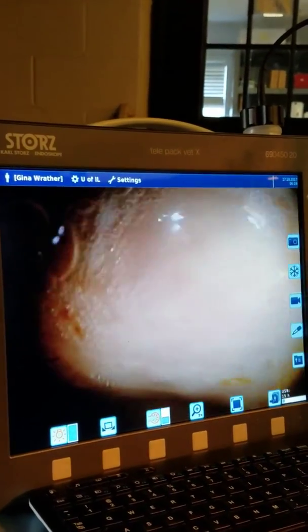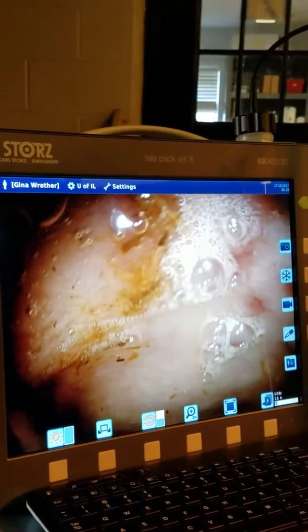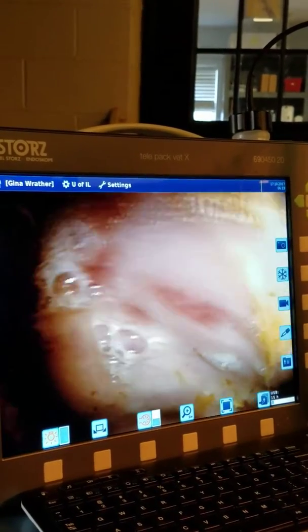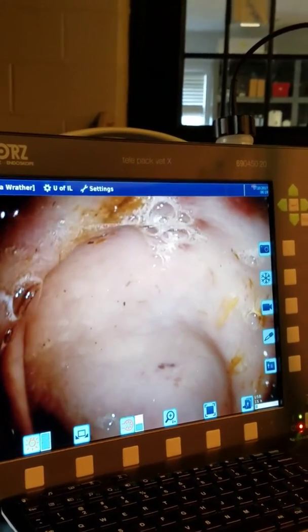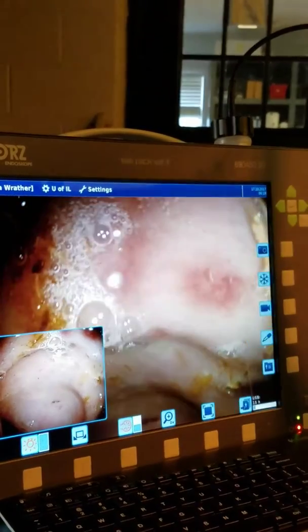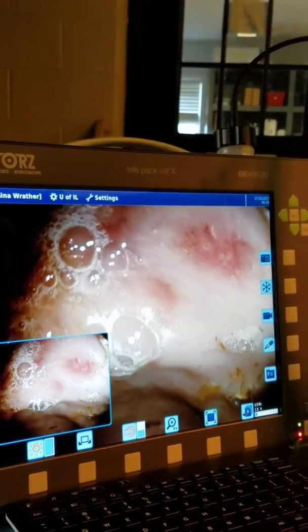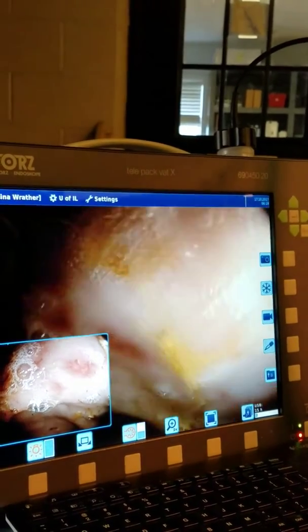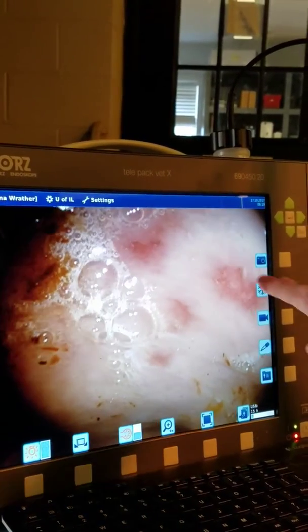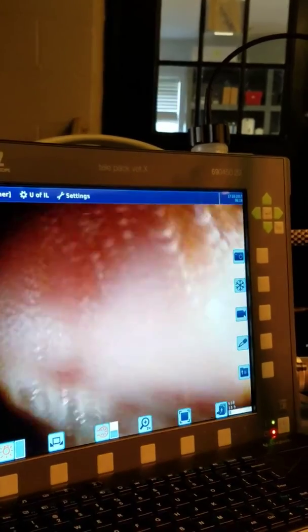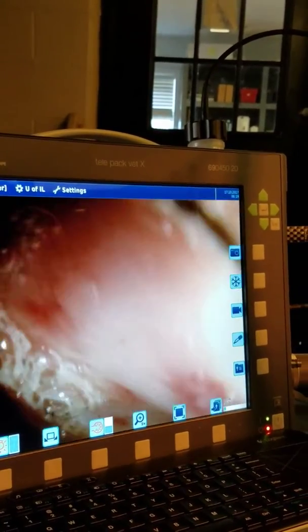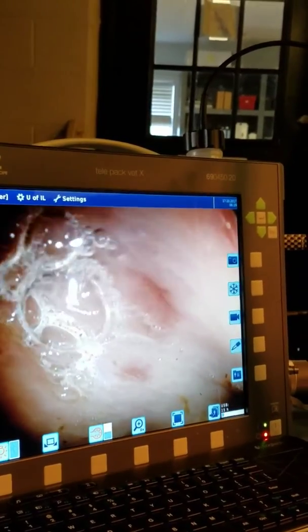So why would there be bubbles in there? It's just another way of that tissue reacting to not being healthy. So it's basically ulcerated — you can almost see there's a little layer of tissue peeling off just a little bit there. I think those are significant. I think they could definitely be explaining some of your signs.